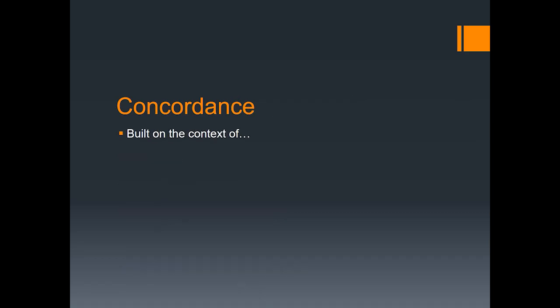So again, to think about concordance, it's built on the context of staying on target, as we discussed in the beginning of the lecture. The patient history, the personal and family risk, all these go into our decision, from the screening to the diagnostic workup, the biopsy, and then the RAD-path correlation as we present results. Everything is considered in the context of risk, patient age, prior history. And so we're always thinking about that.